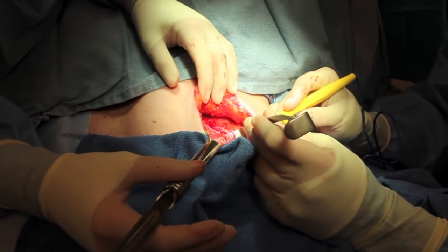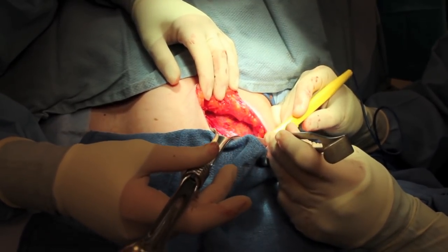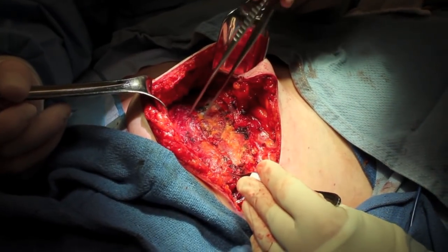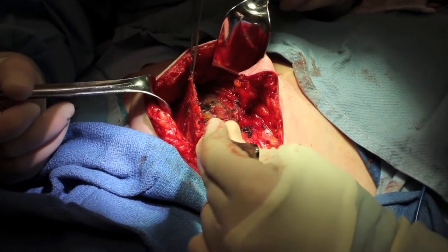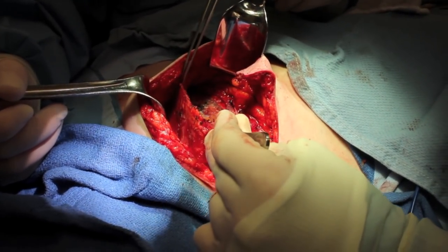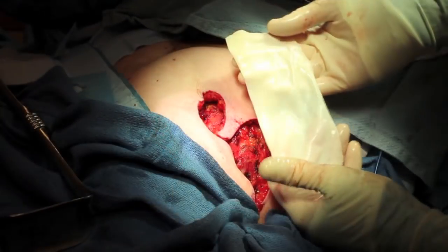Here we are raising the pectoralis major muscle in order to make room for the tissue expander. The pectoralis major muscle has been released and elevated to make room for the tissue expander, and we will suture the allograft sling to this muscle.